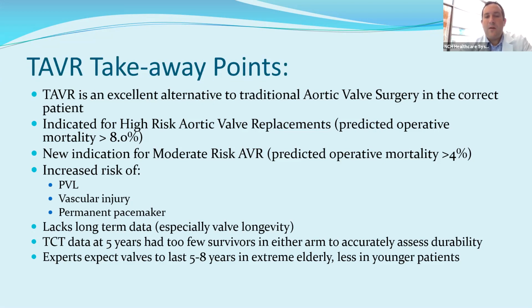So people come by and the most common question is if I get the transcatheter valve, how long is this valve going to last me? The answer is I don't know. Nobody really has a good answer to give that, because unfortunately in low-risk patients, these valves have only been around for about 3 to 5 years. We don't have long-term data to give, especially compared to the surgical valves that have been around for 40 or 50 years.